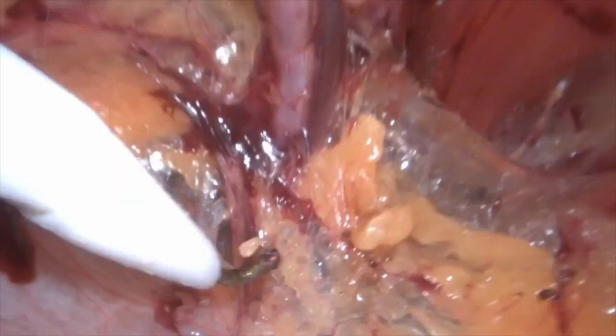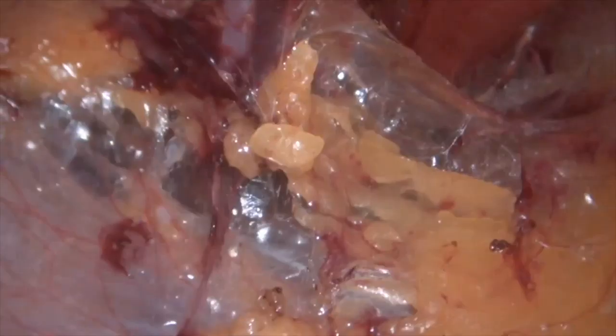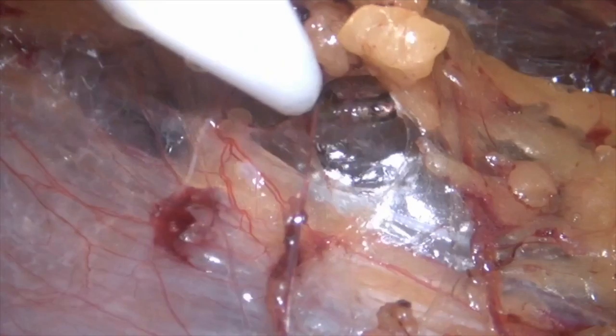You can see the inferior epigastric well. And here we have to take care that we dissect well below the inferior epigastric and make sure that it stays in the roof. If the inferior epigastric is brought to the floor by mistake, then the entire surgery would be confusing and difficult for us to perform. So the first step is to make sure that the inferior epigastric is again taken to the roof, similar to how we are doing it now.